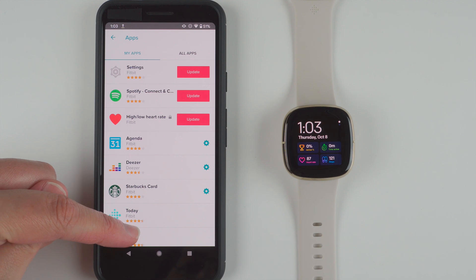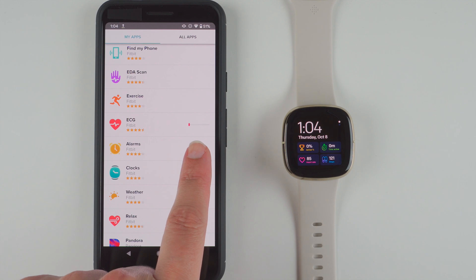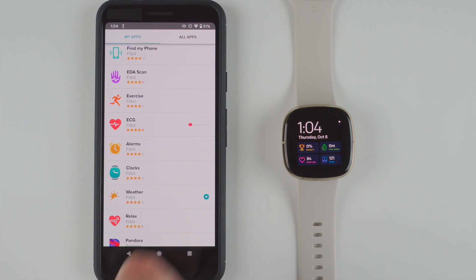It looks like it moved down and here it's showing a little progress bar — the red is going to go from left to right, and when the line is completely red I believe that will be when it's finished installing. We just have to be a little bit patient here. I'm on Wi-Fi so it should go quicker than if you're only on your phone's data. Momentarily it will be done.